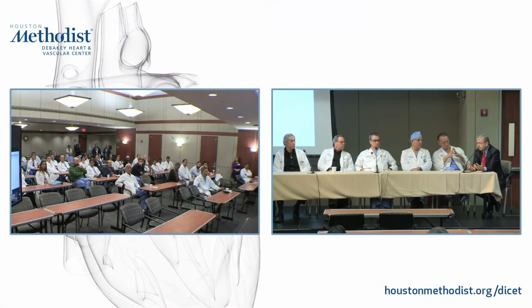We're not talking about endocarditis. We're not talking about other issues. You're concerned about obstruction. The next step is not a transesophageal echocardiogram. I can tell you that. The reason is there's no way you're going to tell for sure that the motion of the prosthesis is normal. The vast majority of the time, you're not going to see it. It's the complete opposite for a mitral mechanical prosthesis. For mitral mechanical, TEE is your second choice.